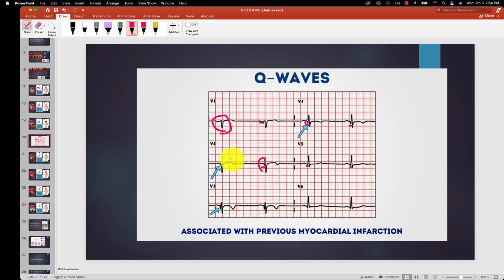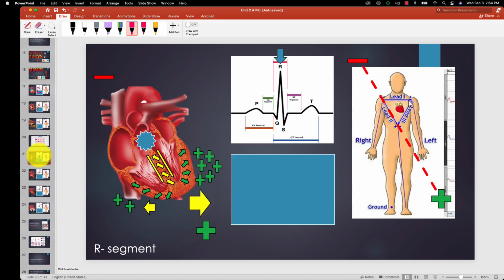So when we have these complications in the heart, the machine will tell us, and it will tell us where it's happening, right? So that's why this is such an awesome piece of equipment. And you guys as exercise physiologists, you need to know this.